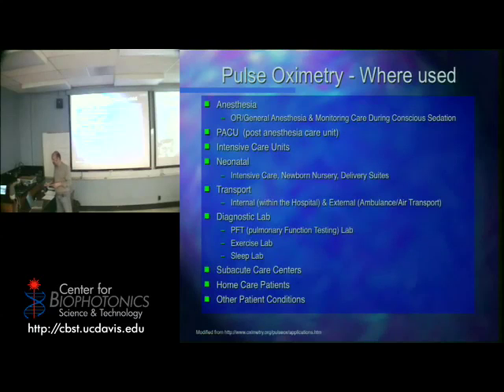Yeah, there's no fiber in there. They don't even use a fiber. They don't need to because the detector is on the finger. Everything's on the finger. All they have to do is send electrical signals. That's all they have to do. It makes it even more reliable. They don't have to worry about kinks. They don't have to worry about any of that stuff. So literally they have the light on one side that they control electronically, and they have the readout on the other side. I mean the pickup.